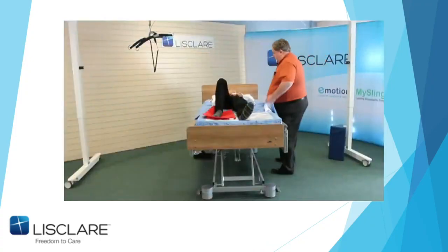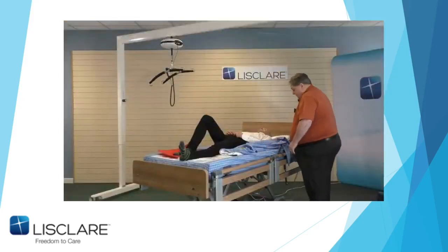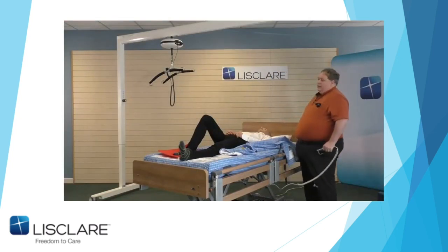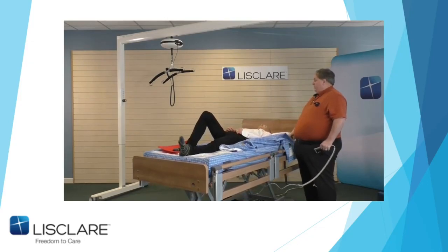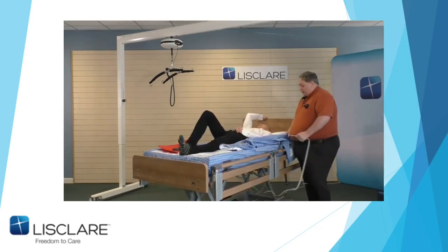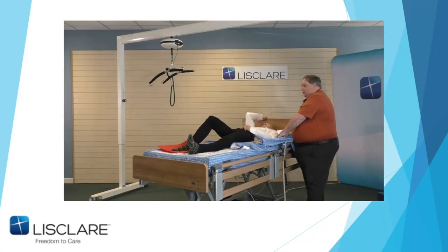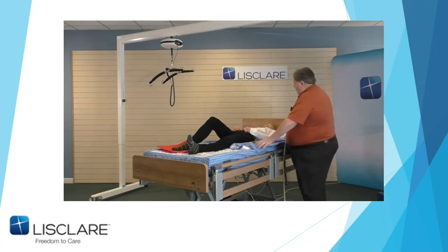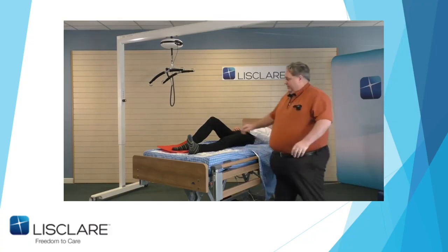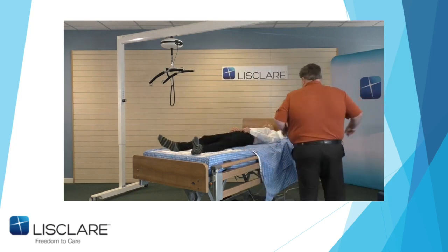Again, because I'm 6'2", this is where John and I work together. Okay. Now, I have even seen in the cases of one client in Mayo in Ireland, that the person reached behind them with their good hand. John, if you reach and just hold the headboard. And at this point, I will stand here and we'll go ready, steady, slide. And John pushed his right hand side up and I just did the left, okay? So now he's in a nice position so I can profile the bed. So John, let's just be feet up, please, and thank you. Thank you, John. Made for that.